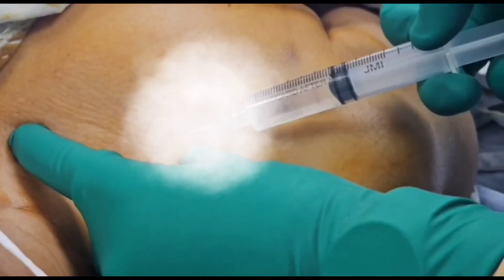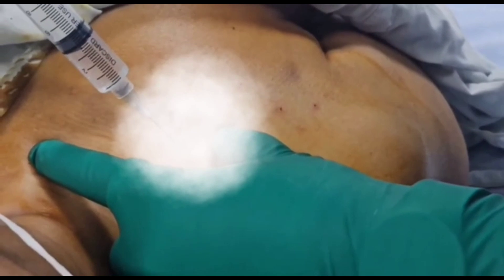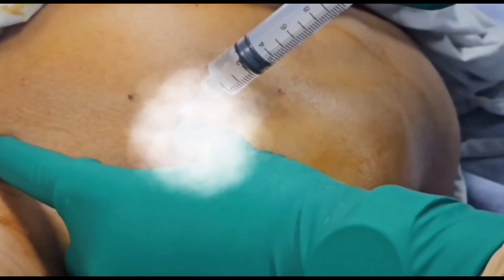We have to put our local anesthetic and infiltrate it at the puncture site to numb the skin.